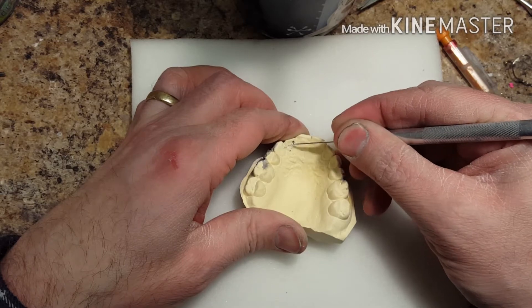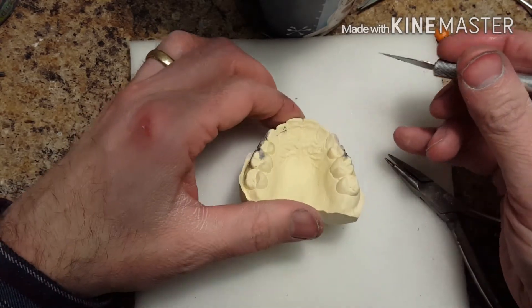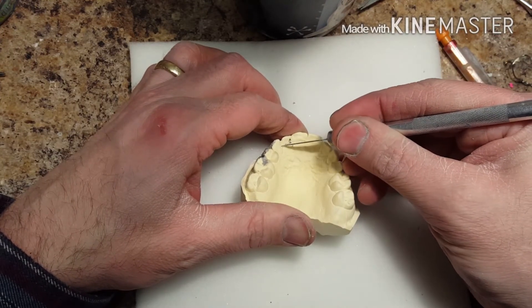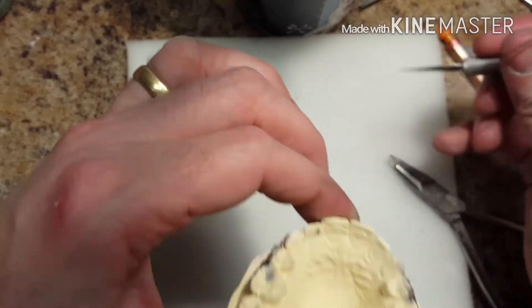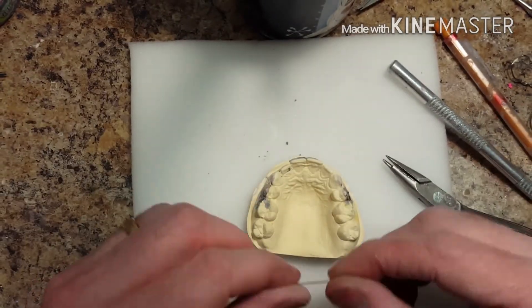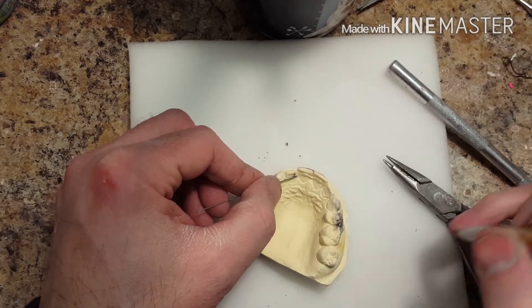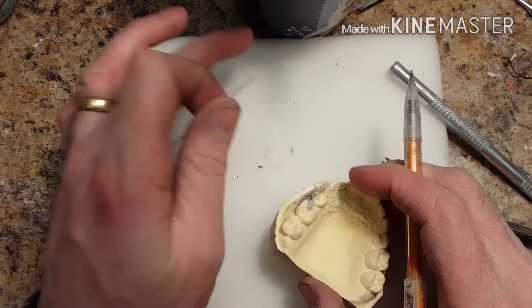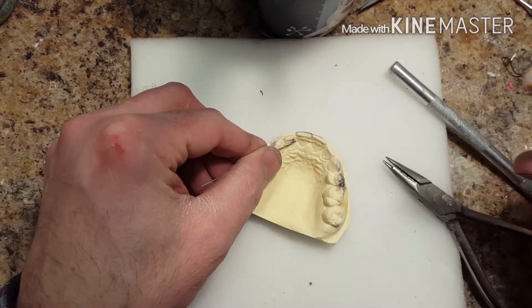First, you're going to see that I'm scoring the model. That kind of gives a pre-activation to the spring when it's actually in the retainer. So when I bend the wire, the spring is going to sit right in there — already putting about a half a millimeter of pressure right on the tooth from the get-go. Otherwise, the doctor has to activate the spring, and typically it's rather passive.